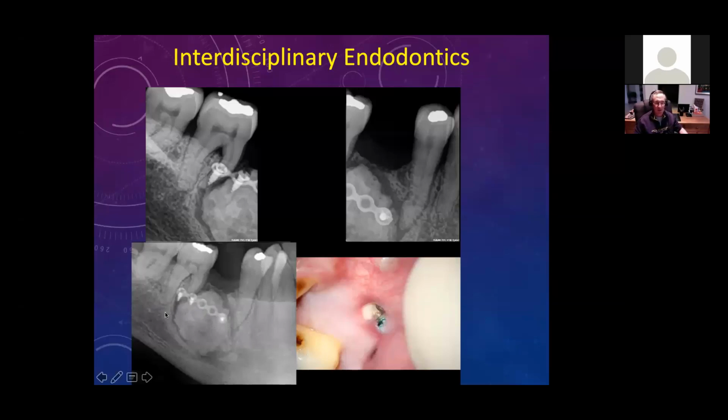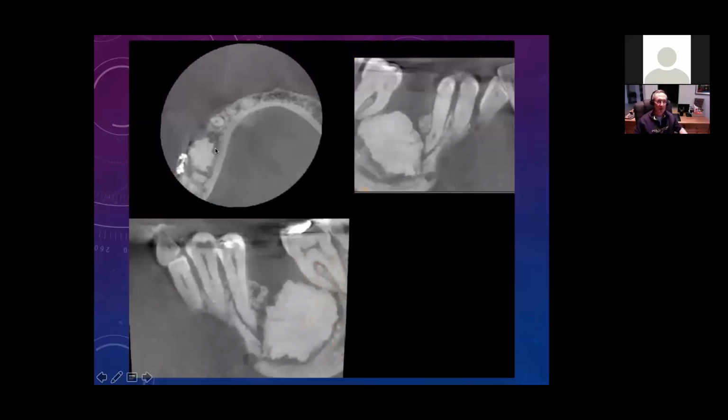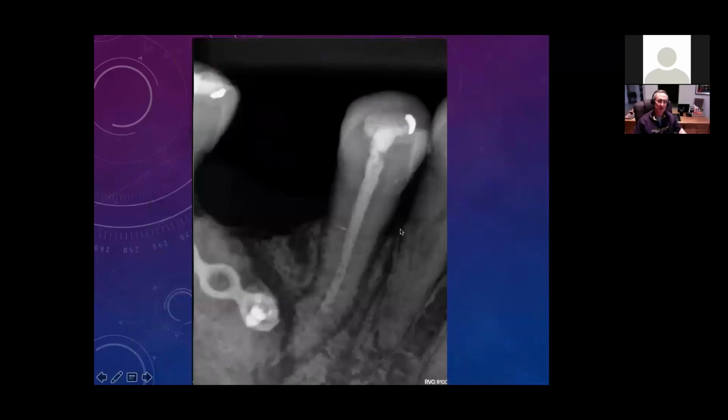I also mentioned the periodontist is interested in the relationship here to the inferior alveolar. So the scan showed us that, in fact, the screw is not sticking into the mesial root, just superimposed on the other, on the PAs. And it answered the other questions that I mentioned.